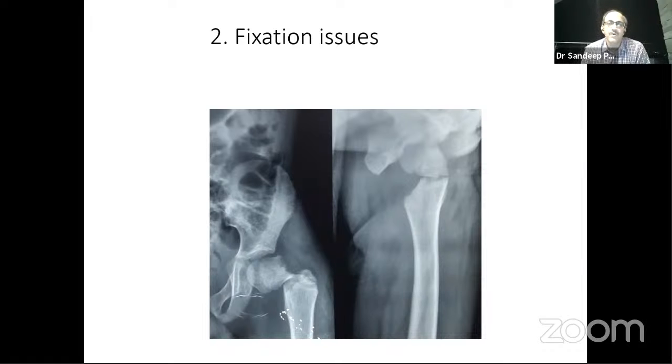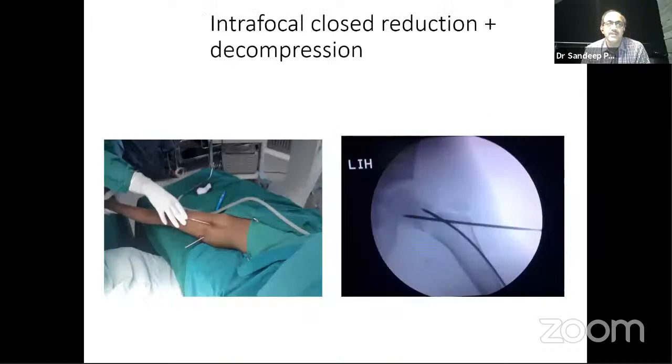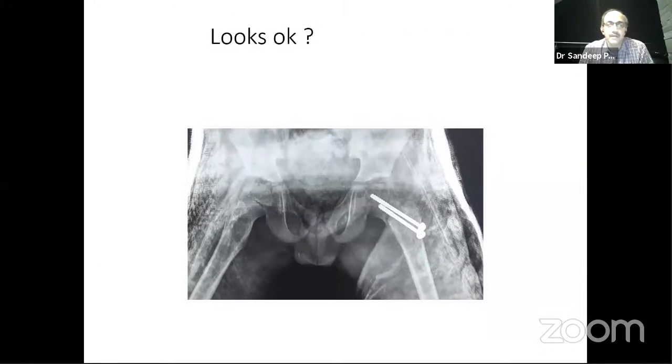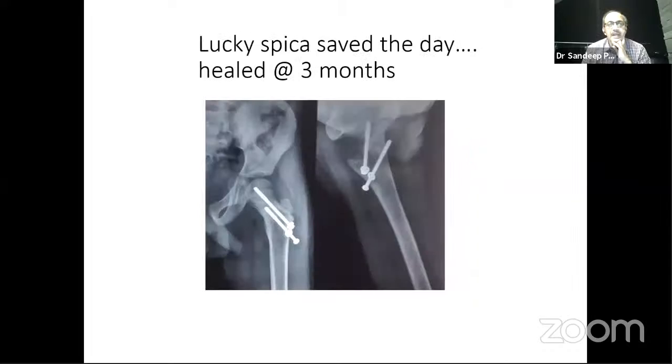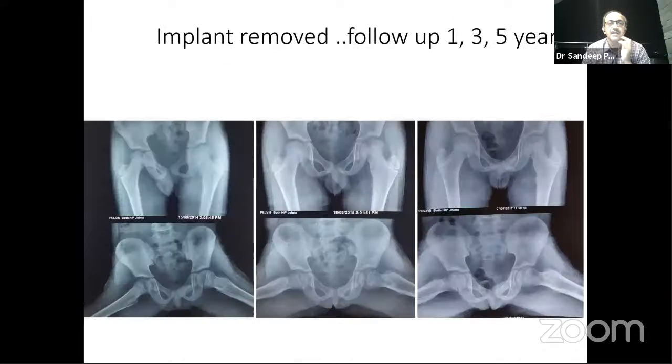Now, this child who had a displaced type 2 fracture was treated with a percutaneous leverage technique and closed reduction, and a couple of cancellous screws had been put. Now, these screws, if you see, the top screw seems okay, but the lower screw was short, and as expected, it cut out. It did not have any purchase. Now, poor fixation is the commonest cause for creating a non-union or a malunion. And luckily, because there was a spica that saved the day, this went on to heal pretty well at 3 months. And we just got lucky.